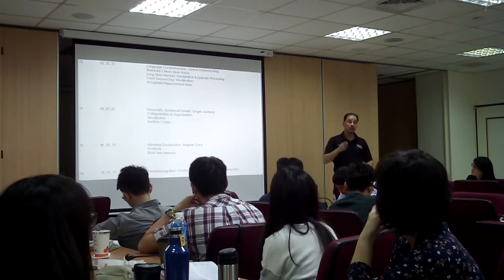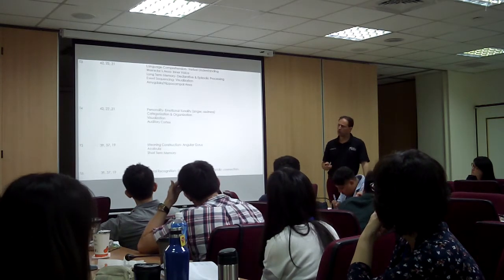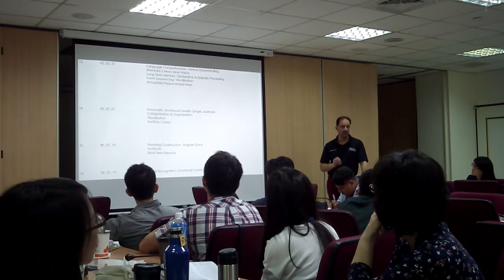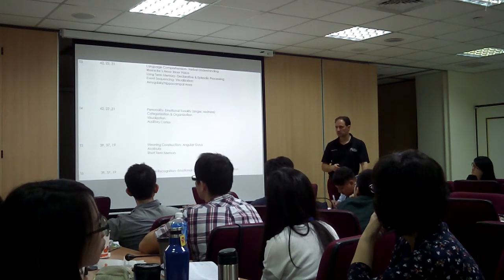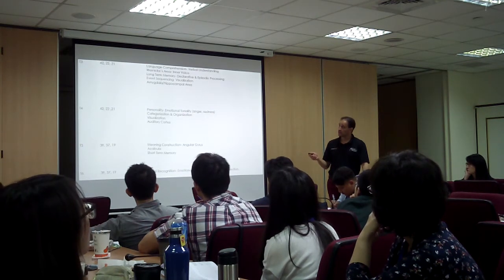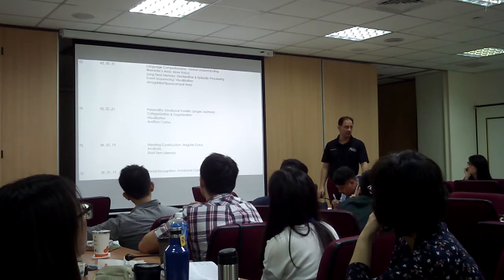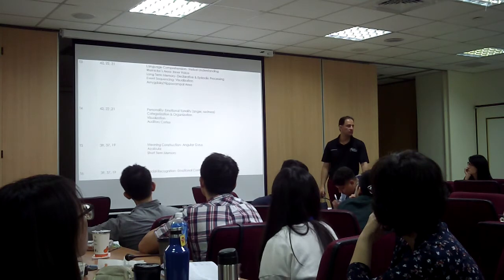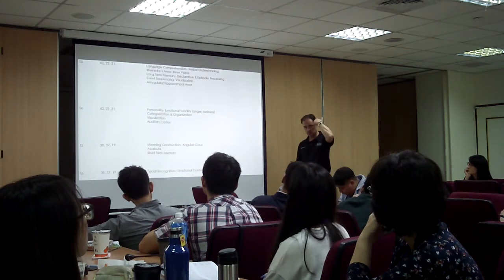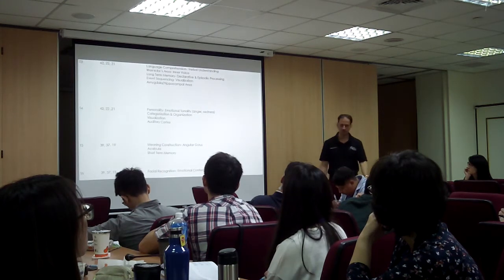Now, with epilepsy or seizure disorders, you don't always have to place the sensor at the source of the problem, but it helps if you go that route. T3 is also for anything language related. So stuttering, stammering, forgetting words, that's an F7 to T3, the whole area that encompasses your Broca.